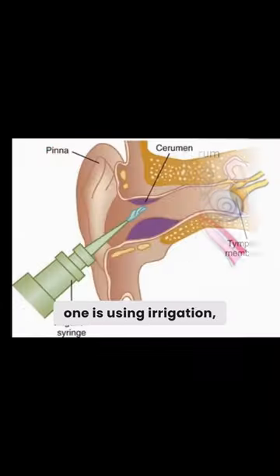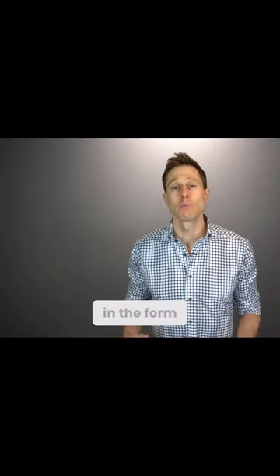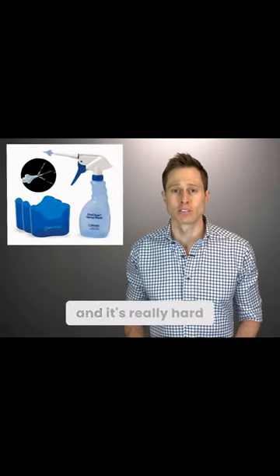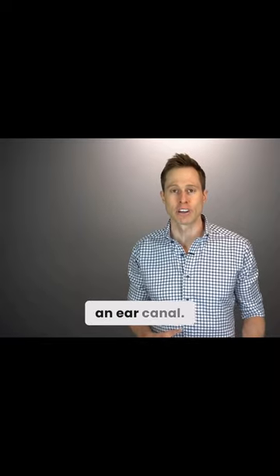And the third one is using irrigation, which is basically flushing earwax out of your ears. Most irrigation systems come in the form of handheld water bottles, and it's really hard to get the amount of pressure necessary to dislodge earwax from an ear canal.